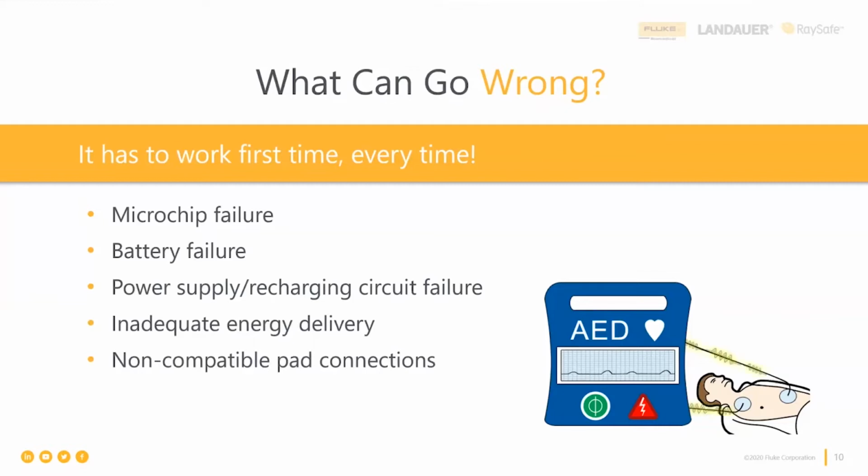And now we've got a patient that can't be treated, or we might have too many higher impedance switchovers across their chest. Yes, right. Exactly. Exactly. So let's move on.